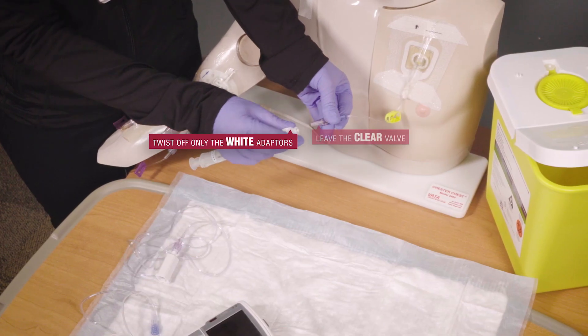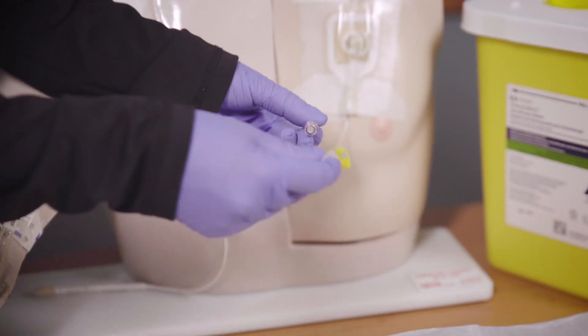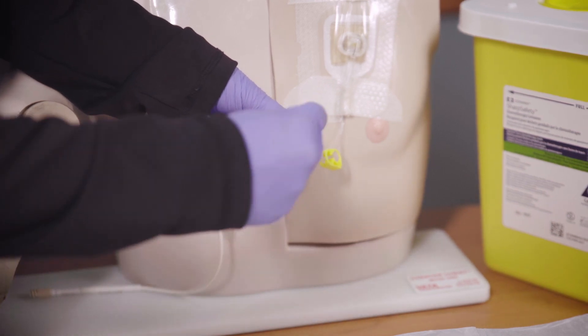Remove the male adapter from the valve by twisting it off. Again, try not to let the valve touch anything, but if it does, scrub with an alcohol wipe for 15 seconds before attaching your heparin syringe.